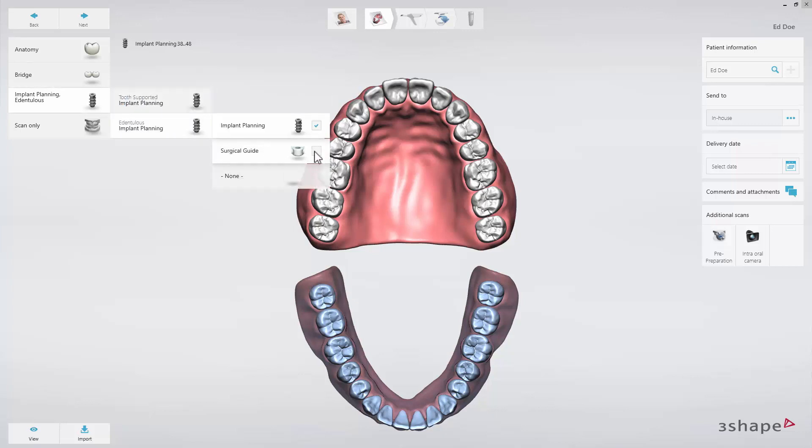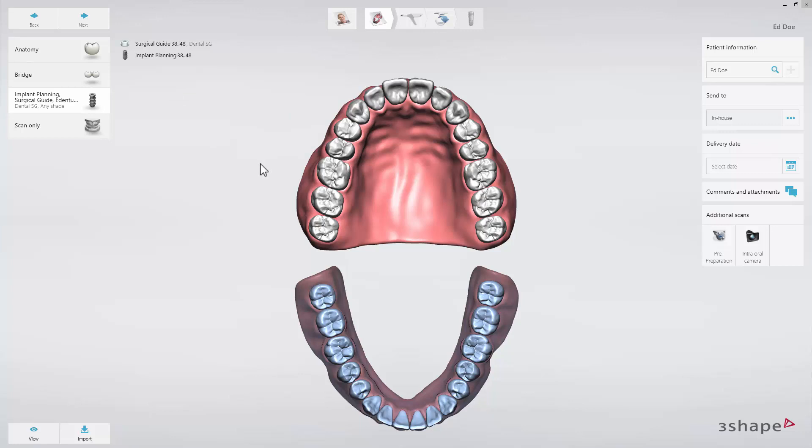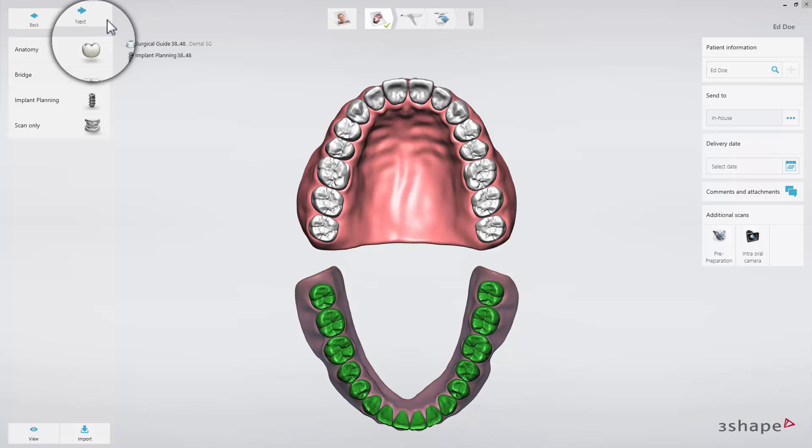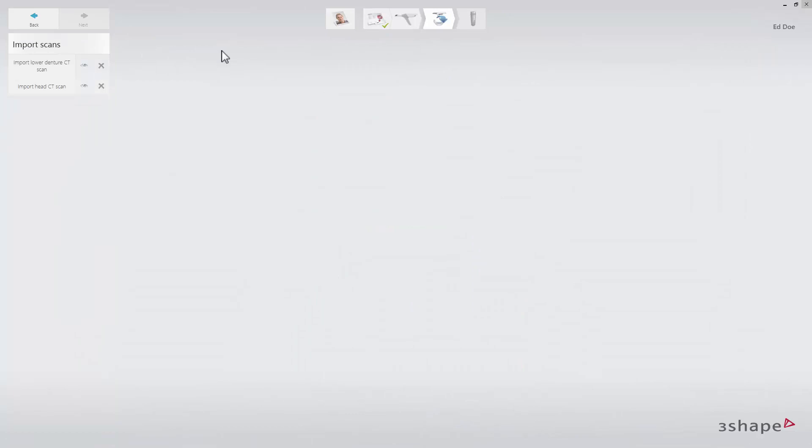We have now created an edentulous case and filled out the order form. Click next to proceed to the next step. Keep in mind that an edentulous case follows a dual CT scan protocol.